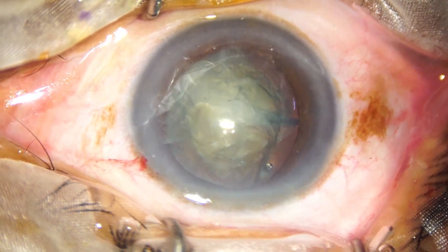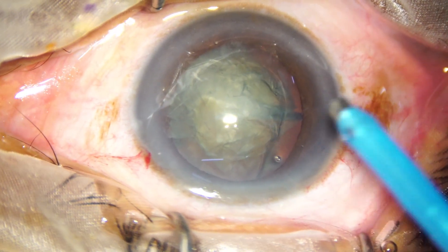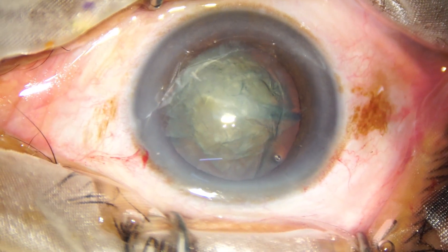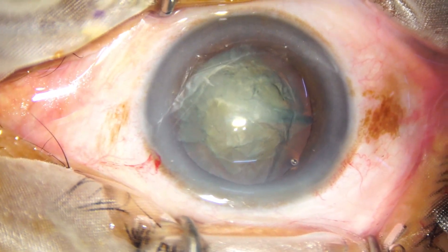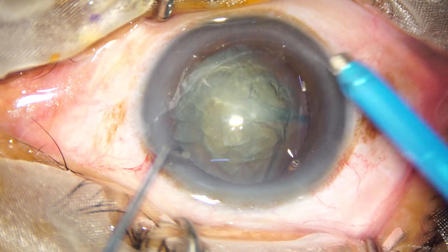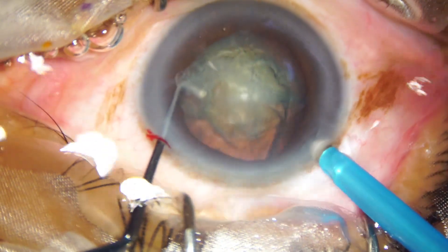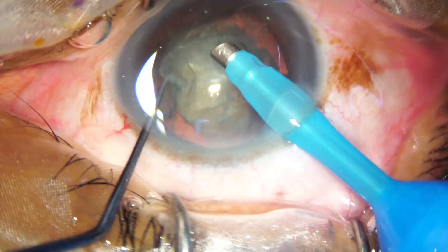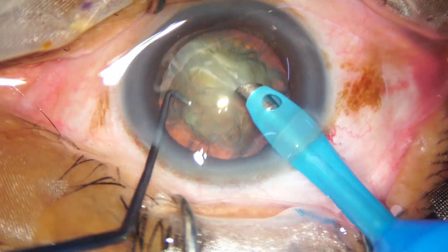Again, the anterior chamber is filled up with viscoelastic. Now the handpiece goes in with the bevel down, and some superficial lens matter is removed.